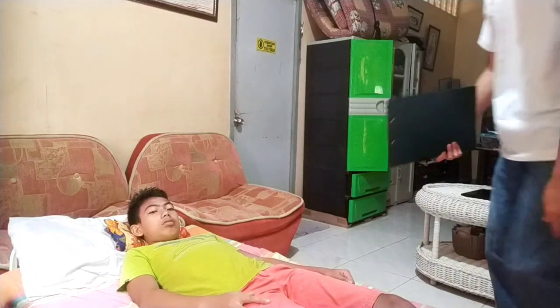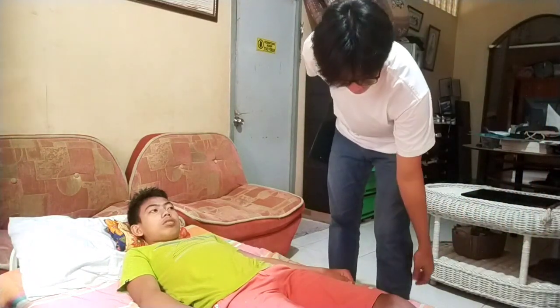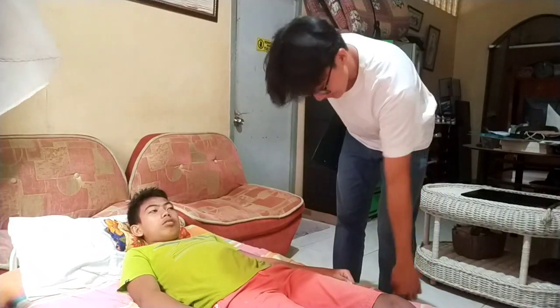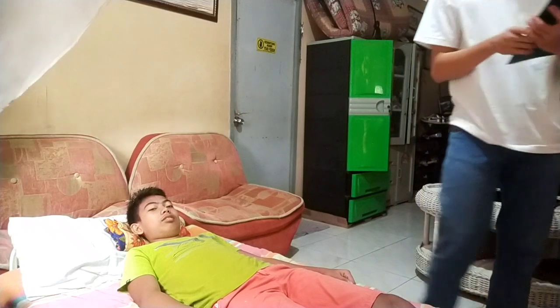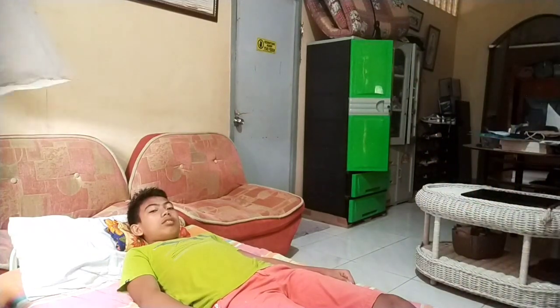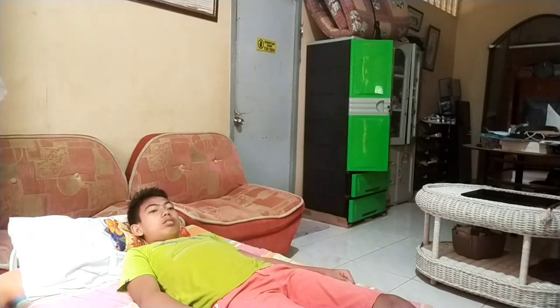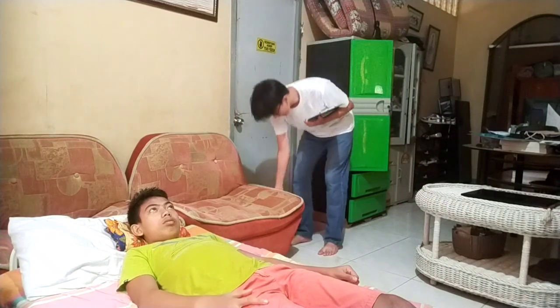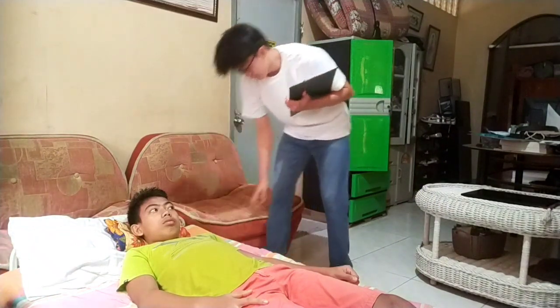So let's pretend I have a mechanic that will lock the bed here or lower the bed. It's now secure. So place the wheelchair parallel to the bed as close to the bed as possible. Put the wheelchair on the side of the bed that allows the client to move toward his or her stronger side. Lock the wheels of the wheelchair and raise the foot plate. So pretend this is our wheelchair. Lock, raise the foot plate.